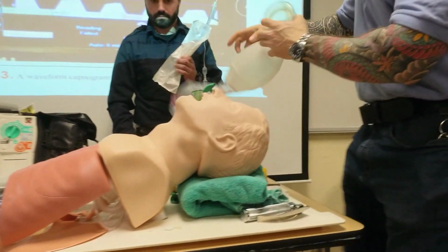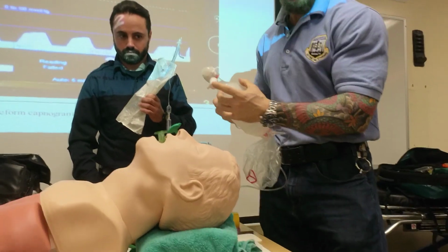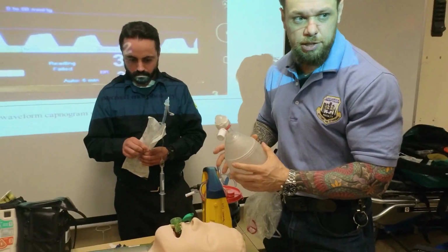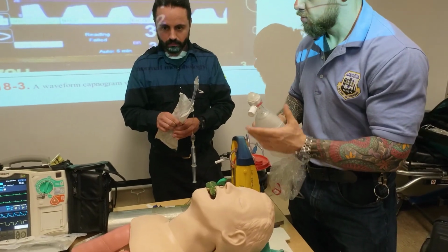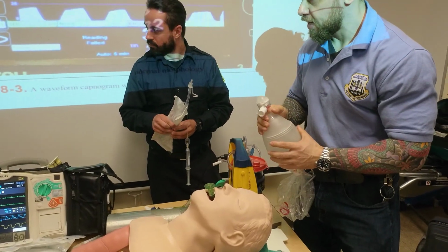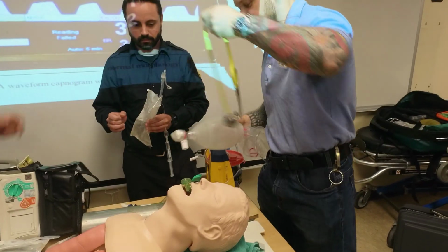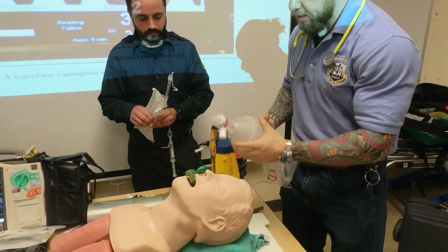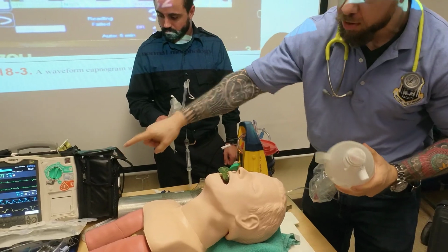Since I don't have it connected, I'm going to connect my end-tidal. Here. It's already here. Does anyone have a stethoscope on them? Yeah, can I borrow it for a second? Oh, perfect, I like the neon. So stethoscope, and here I have my end-tidal CO2. I don't have it connected because I want you to see this number, but it's connected here.